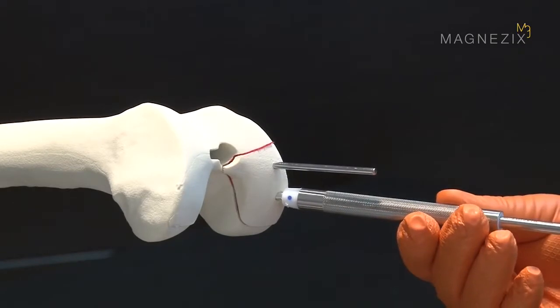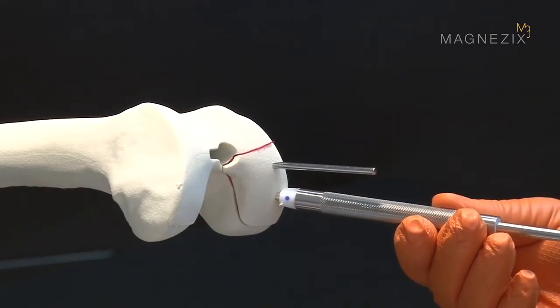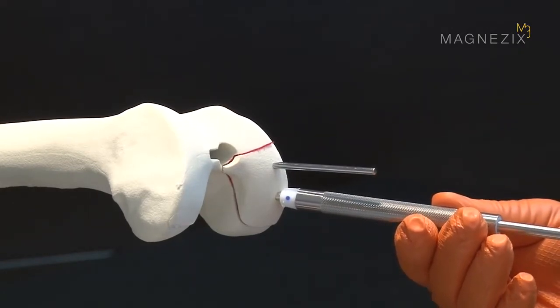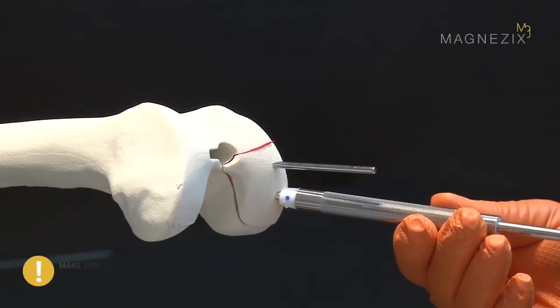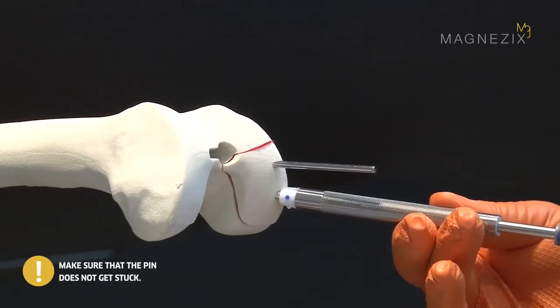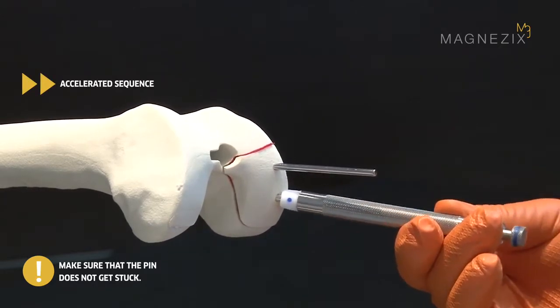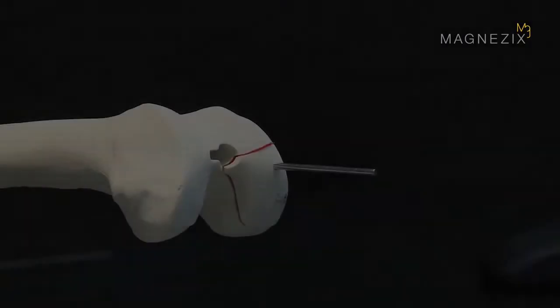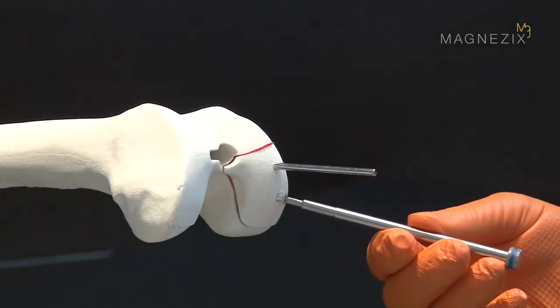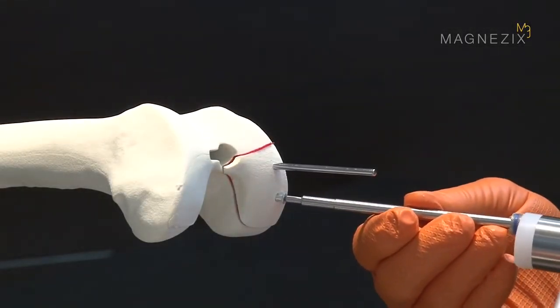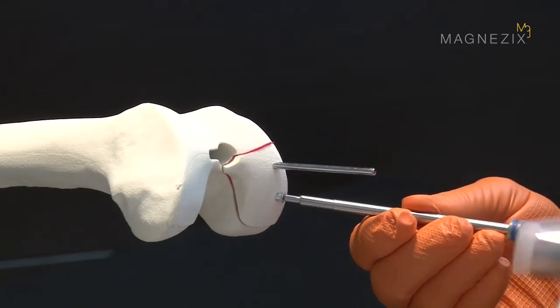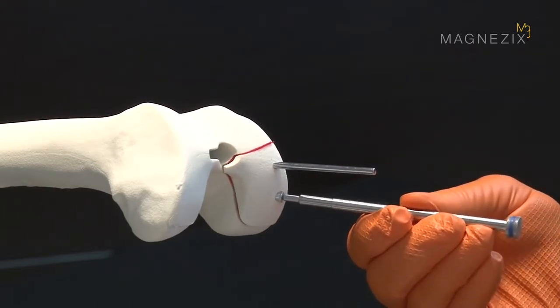The pin is now carefully impacted into the pilot hole using a hammer if necessary. Make sure that the pin does not get stuck during insertion. Only the impactor insert is used for the last few millimeters of the insertion process. This ensures a better view of the implant.